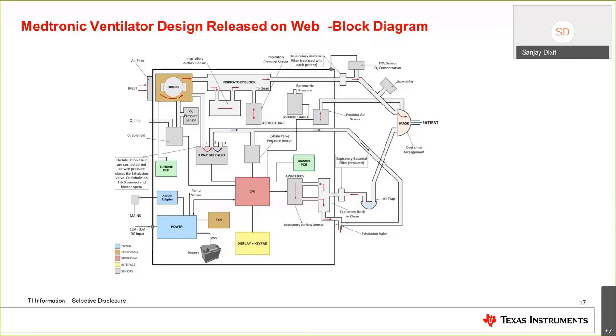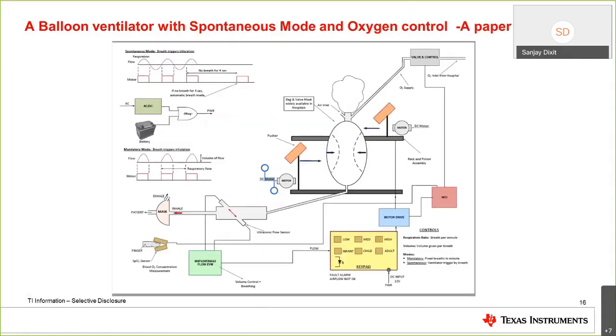So a loud buzzer must ring so that the patient is alerted. On the topic of ventilators, there are a lot of companies worldwide who are now trying to make simplified forms of ventilators. This is because in a professional ventilator, the pneumatics, the pipes, the whole system is pretty complicated, so a lot of companies are trying to make these simplified ventilators, which are called balloon ventilators.